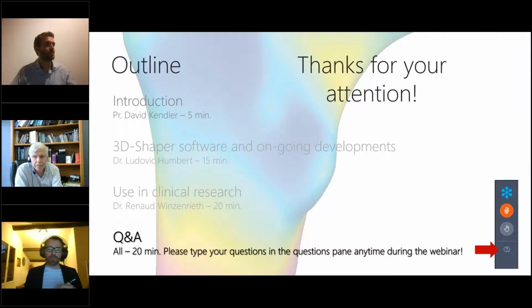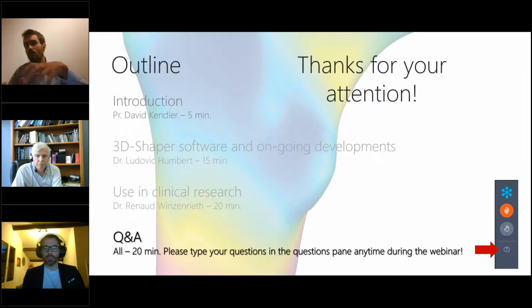Okay, well, thanks for this question. That's a very interesting one. This is not something that we specifically investigated, but we should actually be less sensitive than the 2D DEXA measurements, because the rotation is something that we take into account in our 2D to 3D registration process. In this video, I show you the first thing that we adjust in our model is this rotation. There are precision errors in our method, but if there weren't any, if you take two femurs, one with internal rotation and another one without, it should provide exactly the same results.